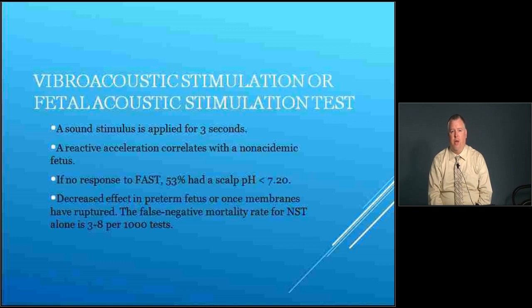A reactive acceleration correlates with a non-acidemic fetus. So that gives us very good information that if we have accelerations, the fetus is not in any acidemia at the time that we're doing the testing. However, if we do the sound stimulus and we do not get an acceleration, only about half of those fetuses were actually acidemic. So it's not a very good test to tell us who's acidemic, but it's very good to tell us who's not. This does have a decreased effect in preterm fetuses because their neurological system is immature.